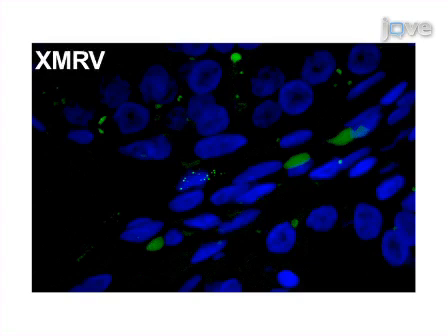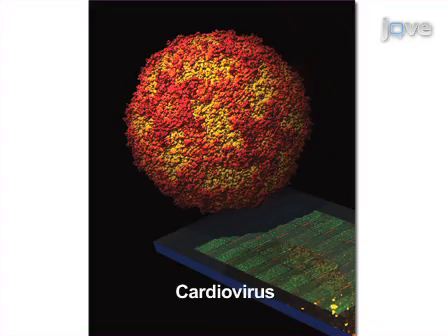Another application of the Virochip is in novel pathogen discovery. Some examples include the discoveries of SARS coronavirus, XMRV, a gammaretrovirus linked to prostate cancer and chronic fatigue syndrome in humans, and HTCV, a novel human cardiovirus associated with respiratory and diarrheal infections in children.